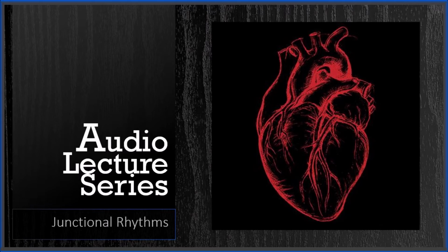With these, you can also see what are called premature junctional contractions. So these are electrical impulses that originate in the AV node and they occur before the next sinus beat. So this is one of the things you can see where if you have some sinus beats going on, you can actually see the heart sort of beat one time in between beats. And what makes this different than what we've discussed before is there is usually a pause immediately afterwards. So there's a compensatory pause.